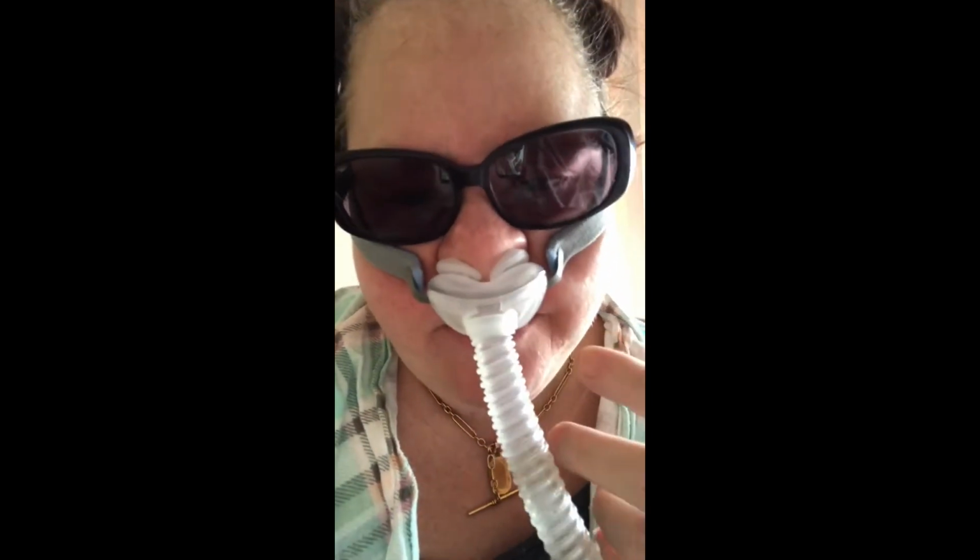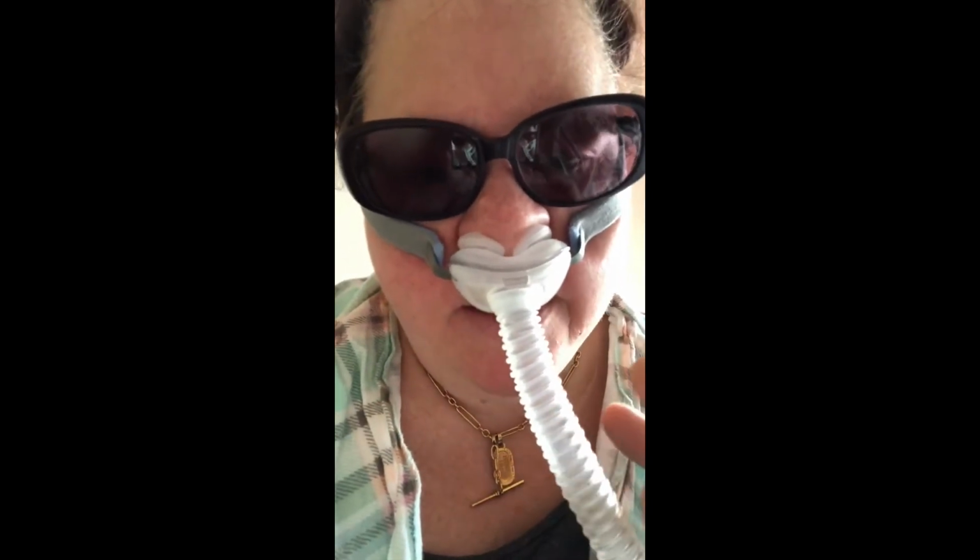So if you can hear this running, this is pushing air through because the machine is noticing that I'm not breathing in through my nose, and this is why it's pushing air through my nose. If I wasn't talking right now and I was just on the CPAP machine simply breathing in and out through my nose, it would be pushing oxygen in. It's usually set at 5. I can't remember what the five is, it's the level of air that it's set. It's set for 5 going in, 5 coming out.